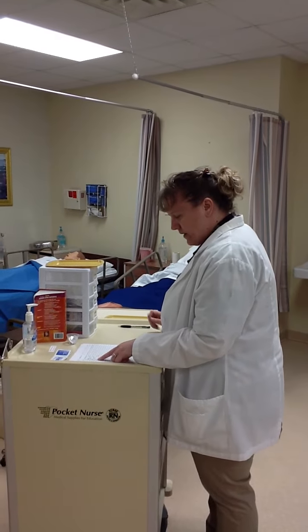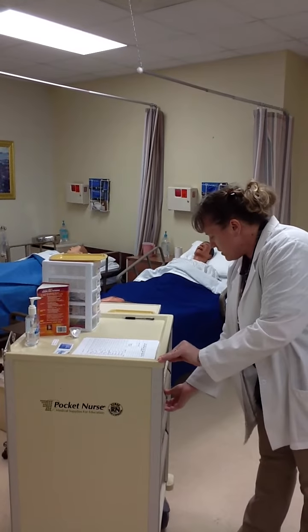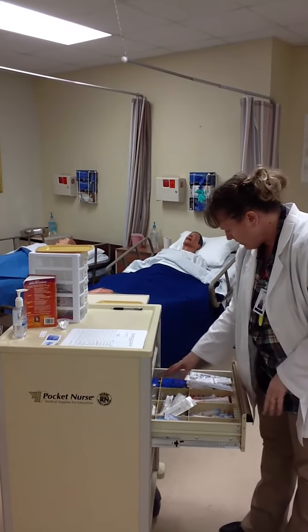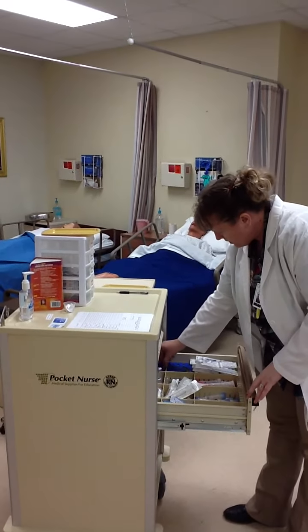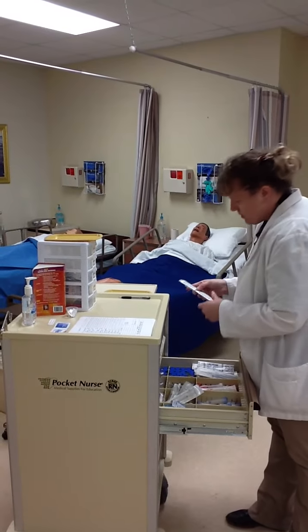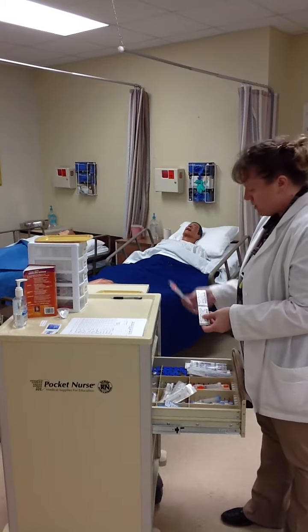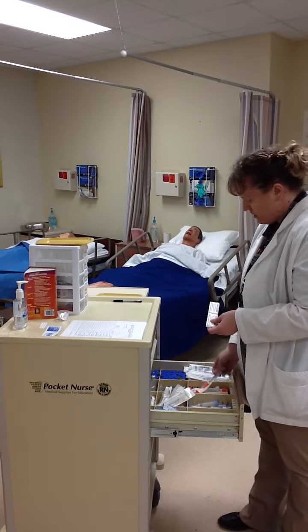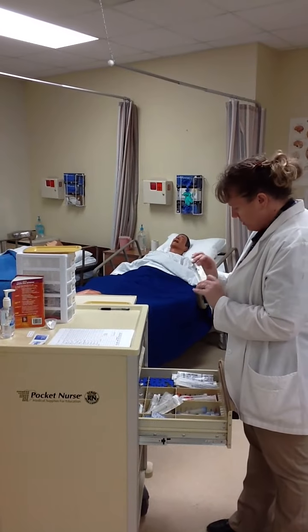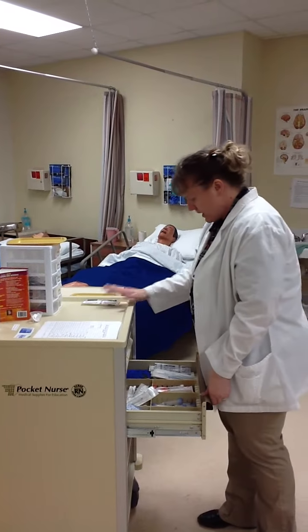I now show that I have a PPD, which would be a tuberculin test. So in the second drawer, I do not show any PPD medication in here, but I do find that I have TB syringes here. You need to make sure that you're checking. It does say TB syringe. Most insulin syringes are orange capped, and you will notice that most TB syringes have a gray cap. You always want to make sure you read because some things are different. So I am going to need that TB syringe.